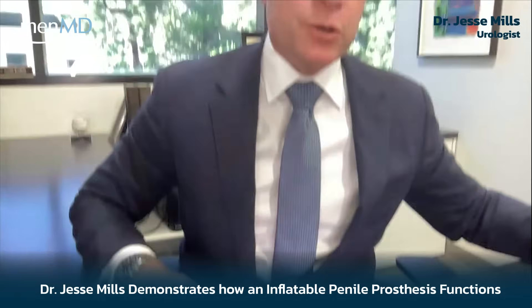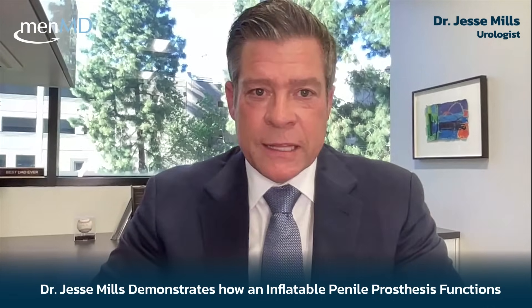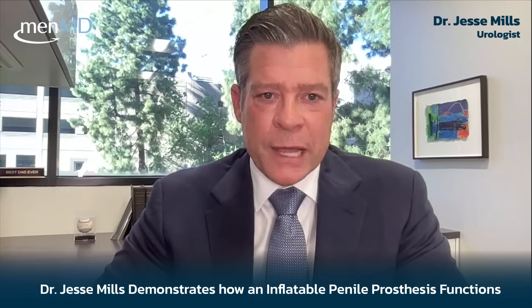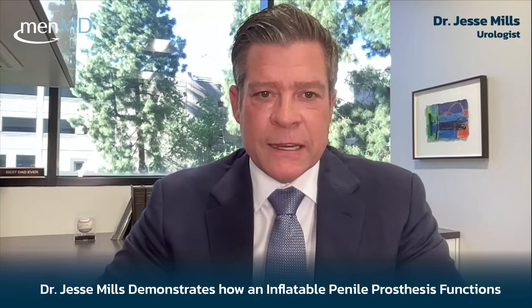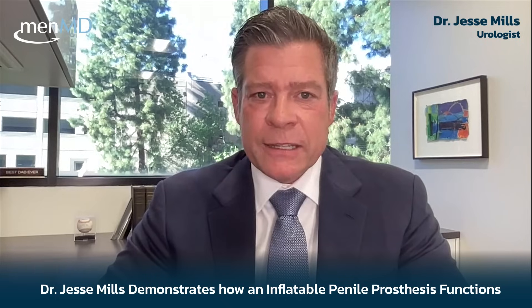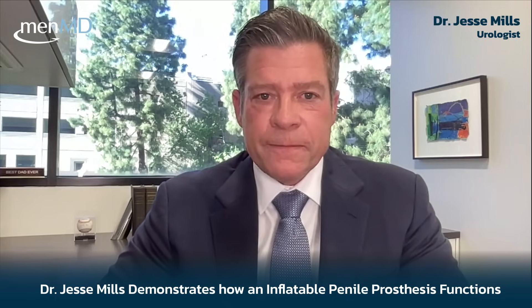You can see the convenience of how you can use a penile prosthesis and how discreet it is. That model really is a real-life implantable prosthesis in a silicone mold, and it does look about like that in a man. It's very difficult to tell someone actually has an implant in place when they're flaccid.